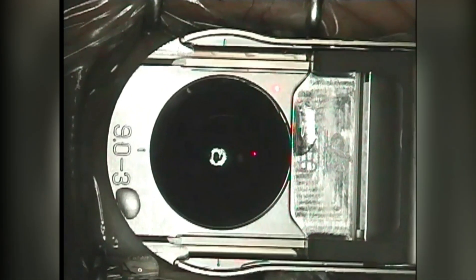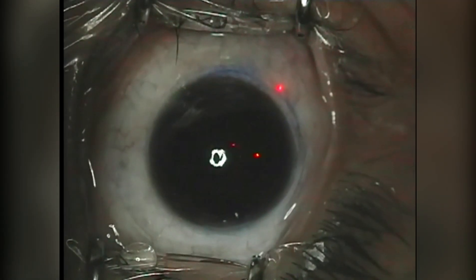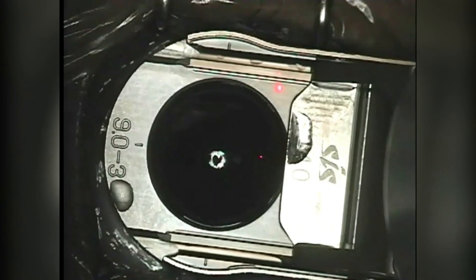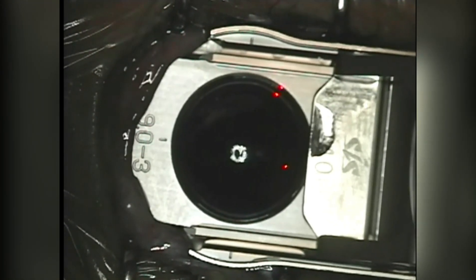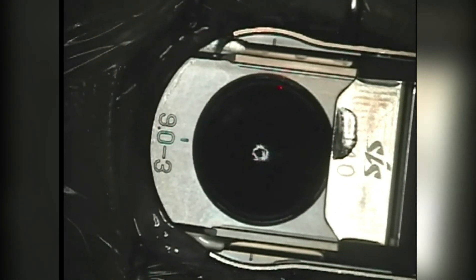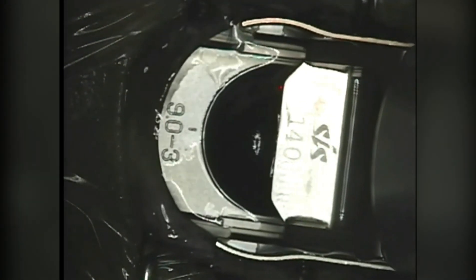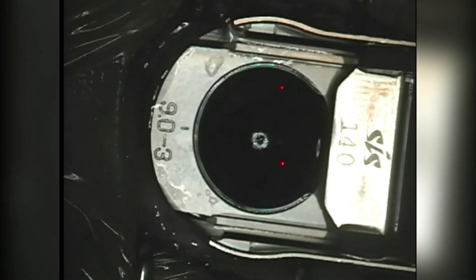To make the flap, the surgeon positions the flap maker on top of the eye. The patient should feel a little pressure but not pain. The flap making machine makes a very precise movement, very similar to peeling an apple very thinly. You will notice that after one smooth pass, a thin flap would have been made on the cornea. Here the flap maker is in place. Pressure is checked to make sure the eye is not too tense, and then a little water is sprayed to facilitate a smooth pass of the machine. Here we can see the keratome blade as it passes over the top layer of the cornea. After making sure it's a full pass, the flap maker is then carefully disengaged from the eye.